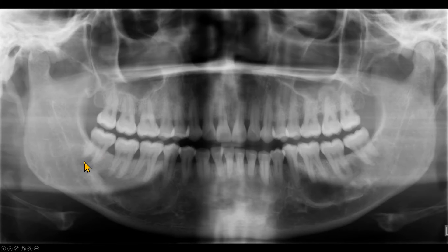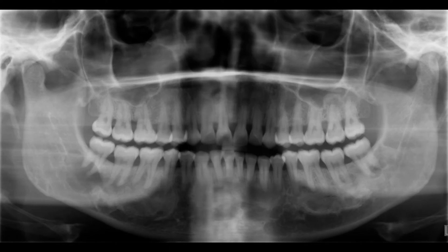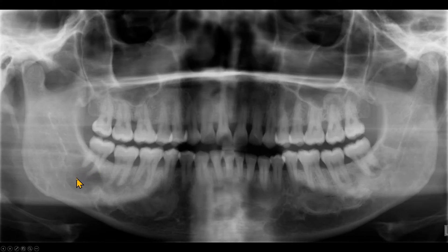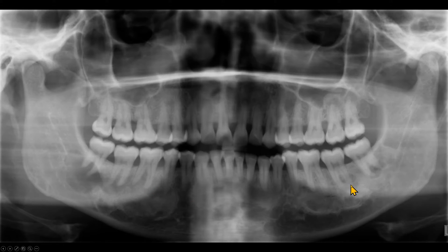One year later, the lesion with the mandibular right third molar is much larger and mostly radiolucent — so this is stage one of the cementoosseous dysplasia for that area. The molar regions have started to show increased radiopacities, probably in stage two or stage three.